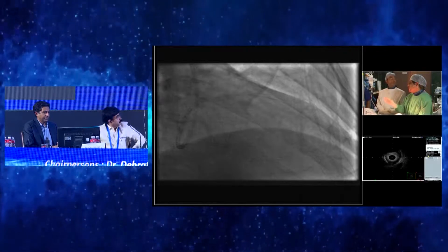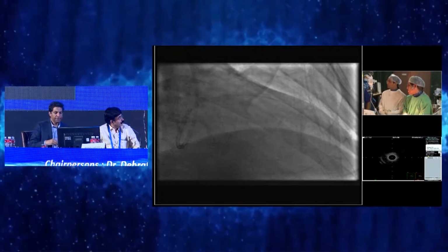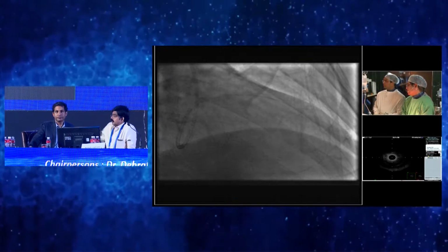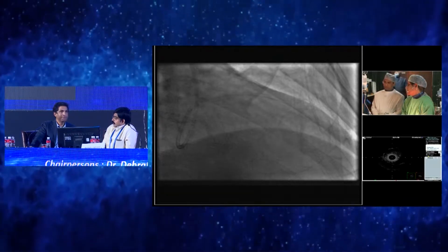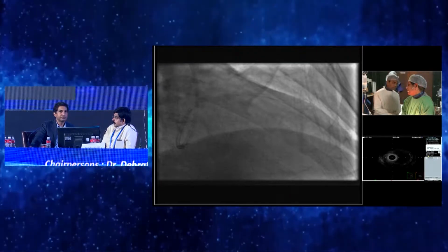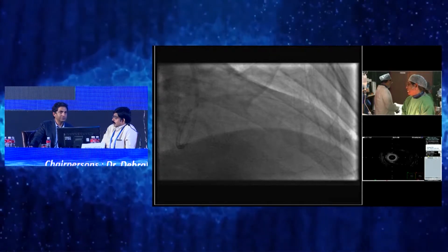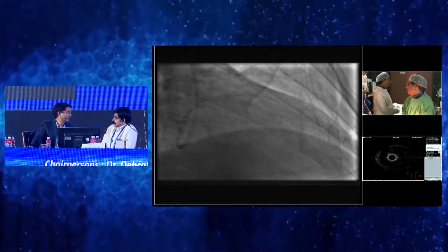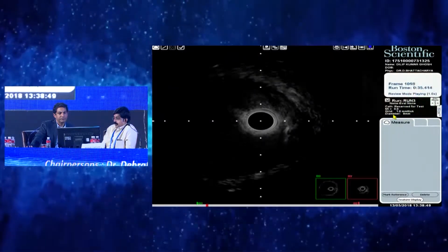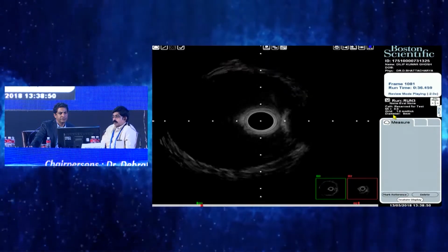No. Just scroll it to the proximal LAD and do a measurement. What is it? 3 can be dilated up to 4.5. Okay. Stop there. No, maybe a bit more. Okay, stop there. So I would have to land my stent here. See, there. And I agree that there is a lot of remodeling there, and it looks like 4.5.